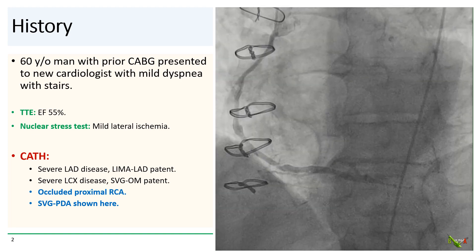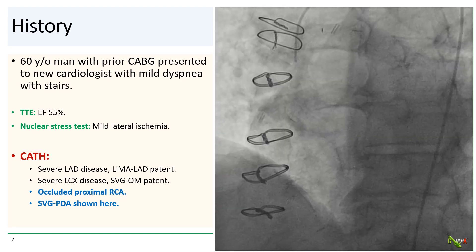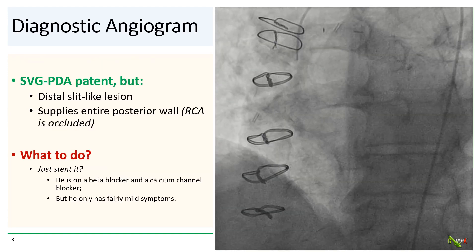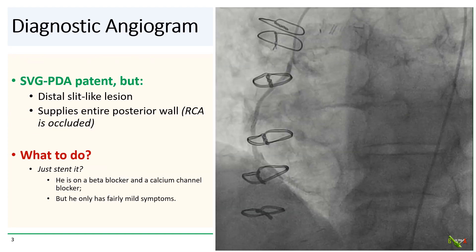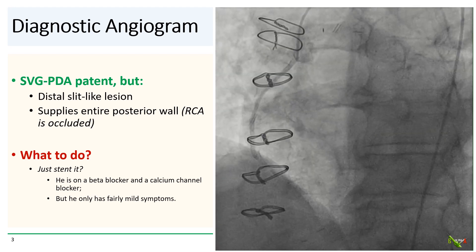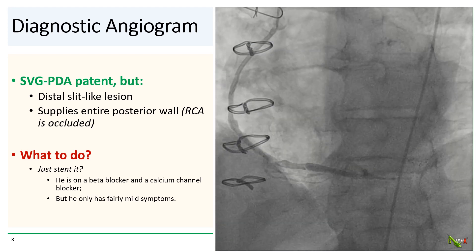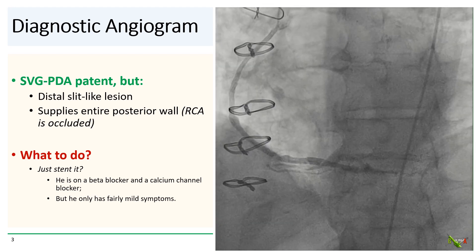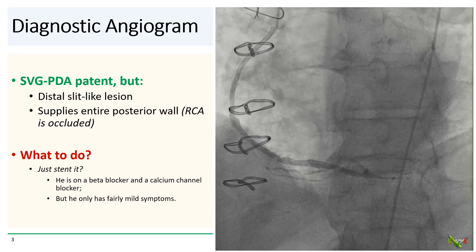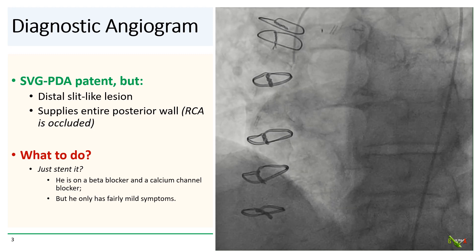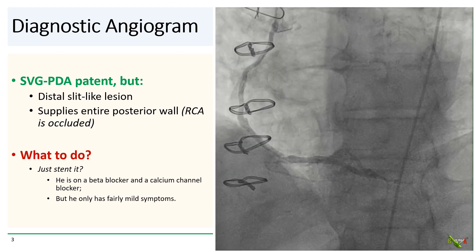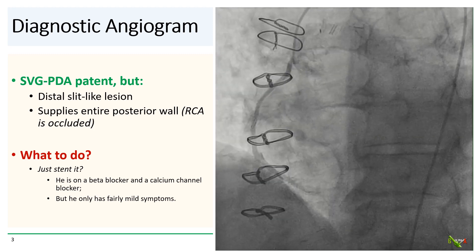There is an interesting lesion in the distal portion of the graft. What we see is a slit-like lesion in the distal portion of the graft that, angiographically at least, appears to be significant. Because the RCA is completely occluded proximally, this graft supplies the entirety of the posterior wall of the heart.